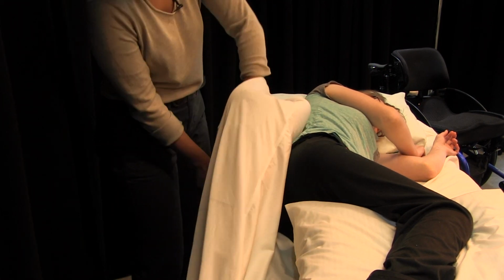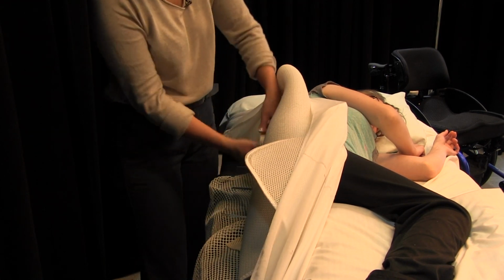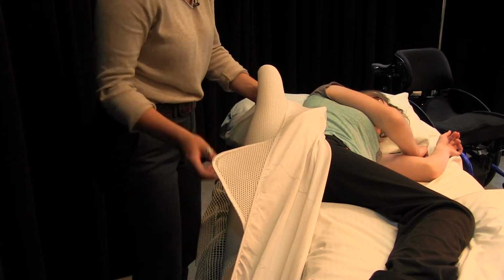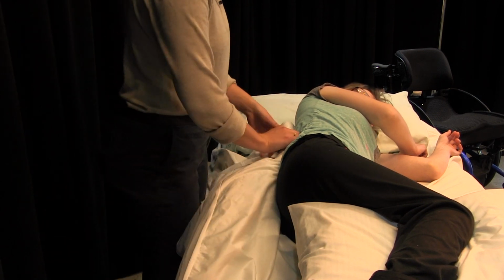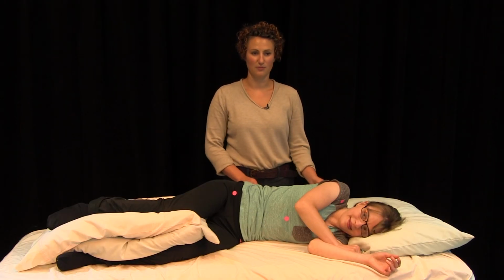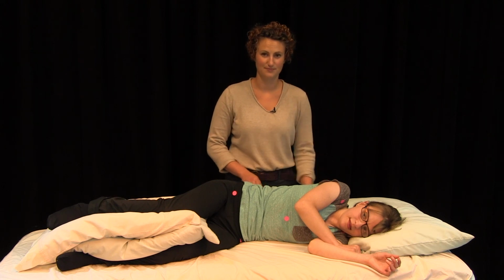One at her low back and one on the upper mid-back. And covered in this cushion layer and the sheets. This support also helps take some of the direct pressure off of the user's bottom shoulder.